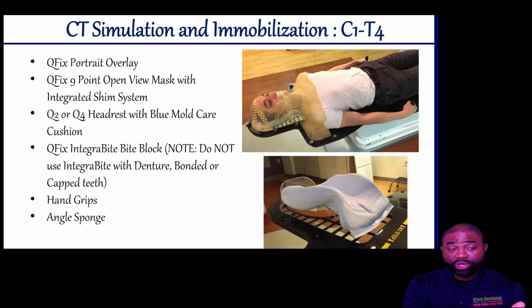And so we always aim to make the patient as comfortable as possible, as well as to use the proper immobilization device to keep the patient still in the course of treatment.